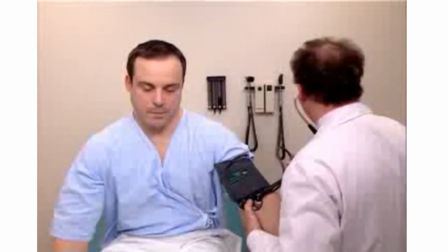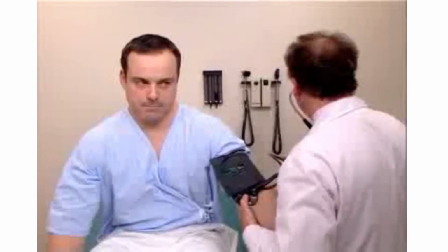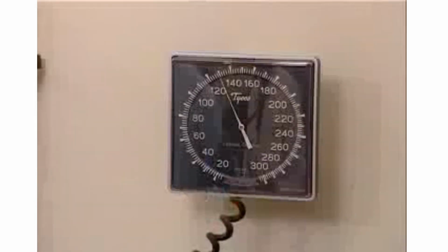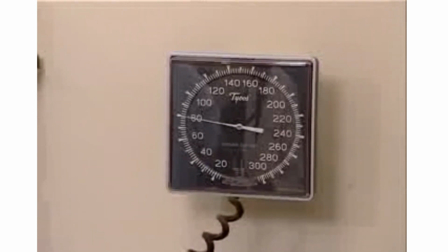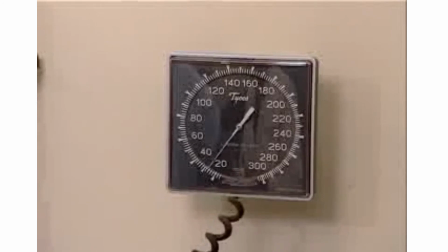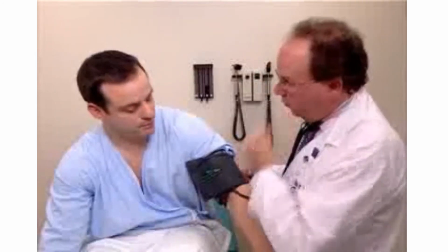And again, blood pressure is determined by pumping the cuff up about 20 millimeters above systolic, and we now record the systolic and diastolic blood pressures. Okay. How do you feel, Mr. Johnson? Fine. Dizzy at all? No. Okay. If orthostatic hypotension were present, we would record a drop in the systolic blood pressure as well as usually an increase in the heart rate. This concludes our blood pressure determinations.